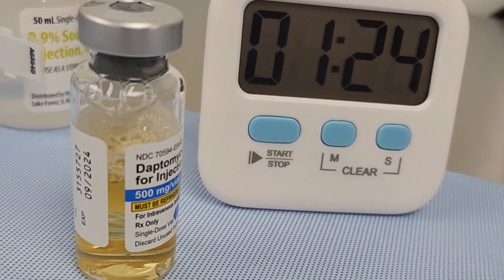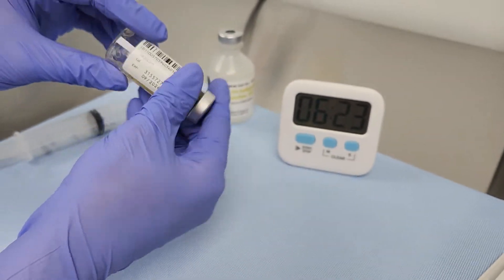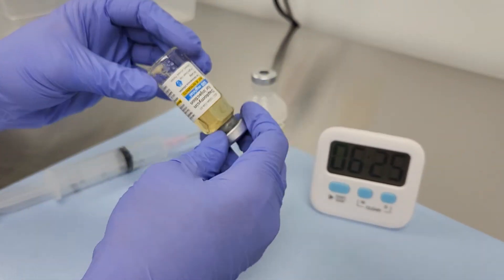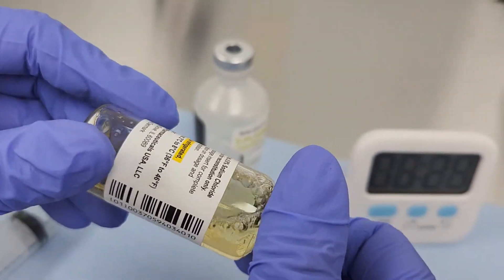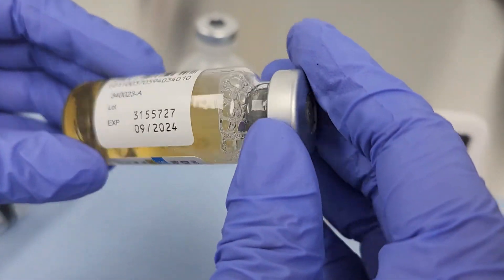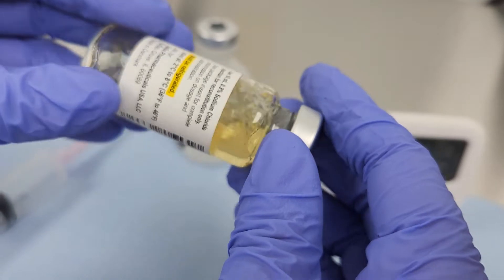Allow the vial to sit undisturbed for about 5 minutes. After 5 minutes, inspect the vial for undissolved particles. Gently agitate the vial again by swirling, tilting, and rolling. Then allow the vial to sit for another 5 minutes.